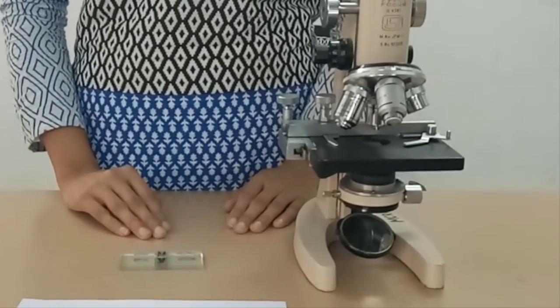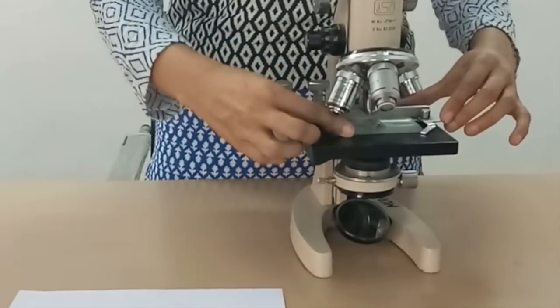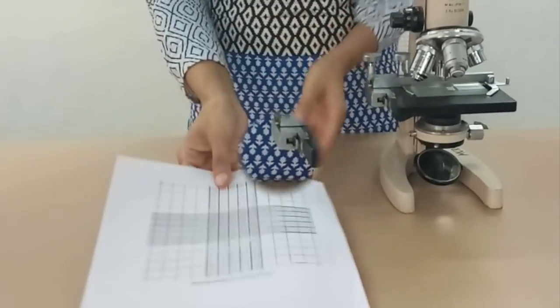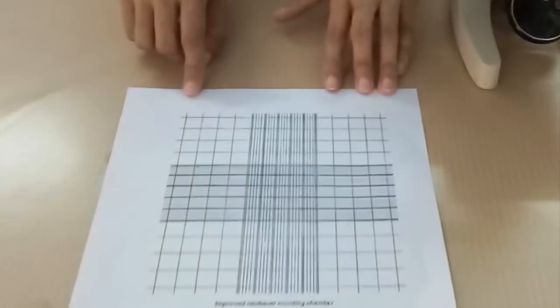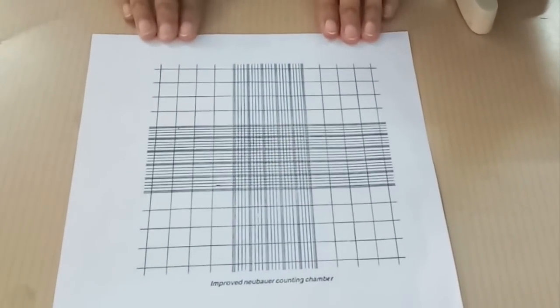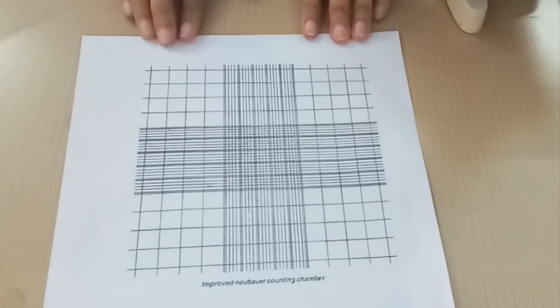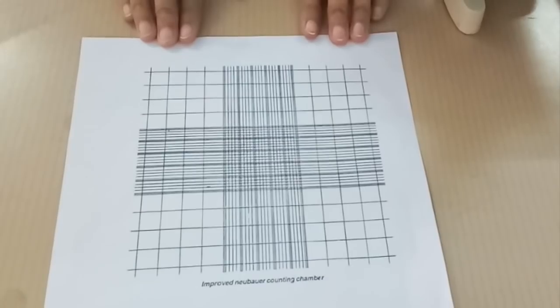Next step is move the Neubauer chamber to the microscope and focus the ruled area. This is the improved Neubauer chamber view under low power. You can see these 4 corner squares, they are WBC counting squares in the Neubauer chamber under low power.